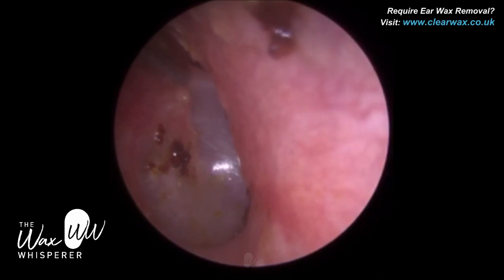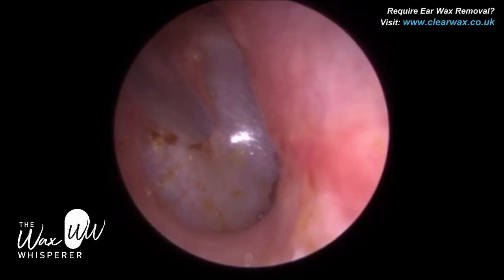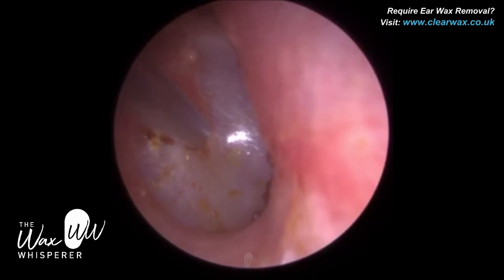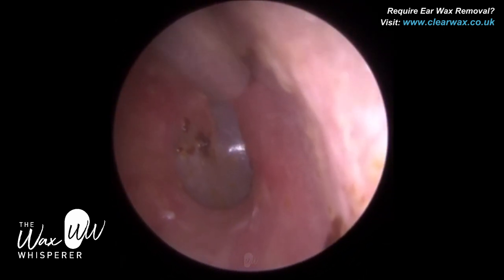So this is the attic region of the eardrum — we also call that the pars flaccida. It's a very sensitive part of the eardrum. There is some wax centrally on the eardrum — we call that the umbo. The umbo is where the hammer bone connects to the eardrum.